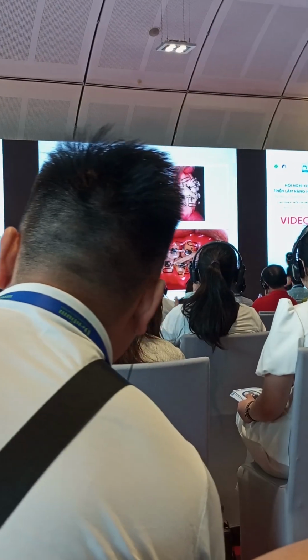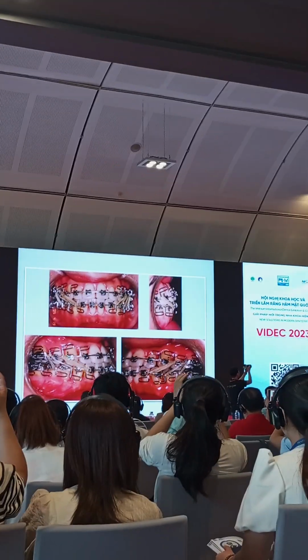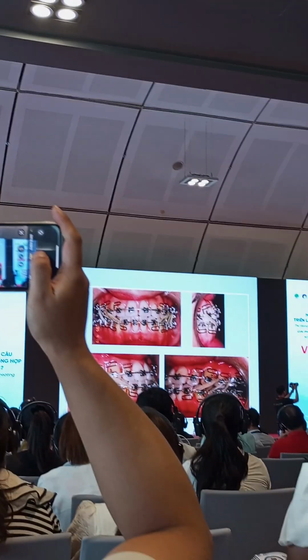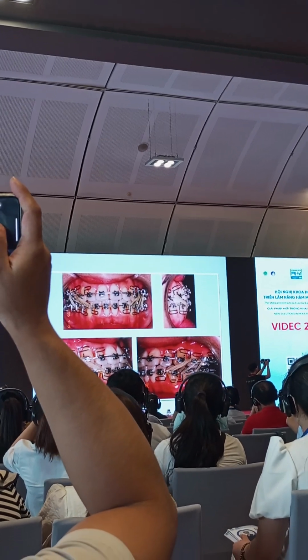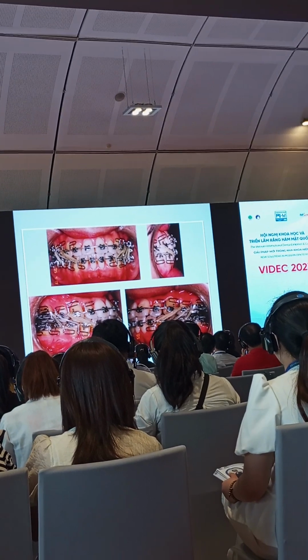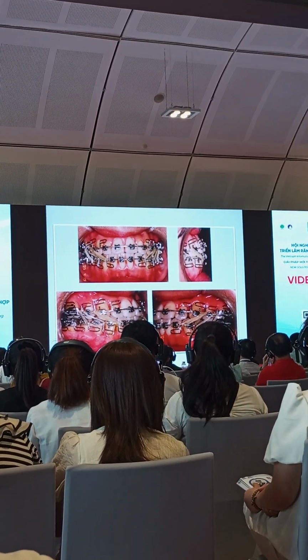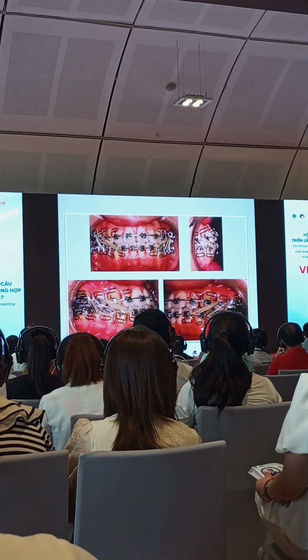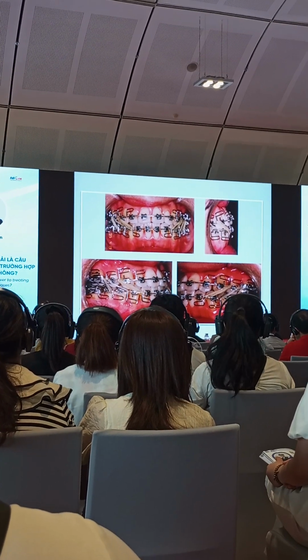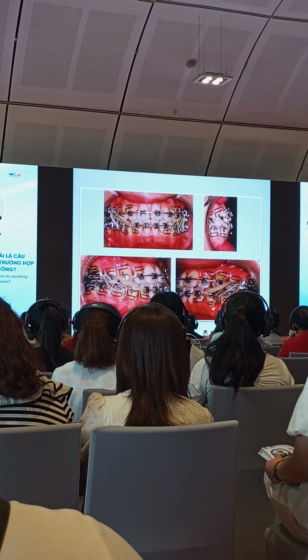So this time, she came, and I asked her to wear double elastic. Double elastic meaning class 3 and a class 3 triangle elastic, because she can stay for 2 months during this time. She was able to ask for a longer vacation from her work. So I asked her to wear this, and then try to correct it before she leaves for the country.